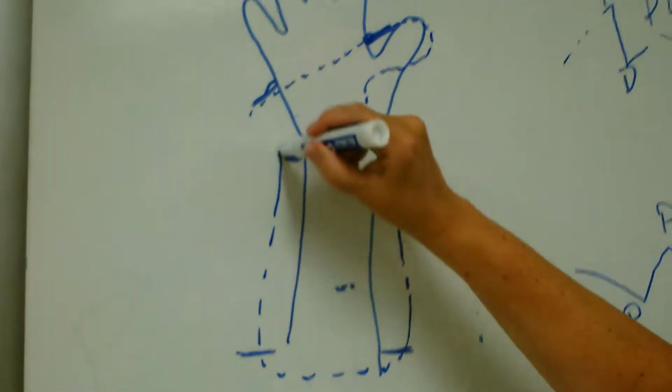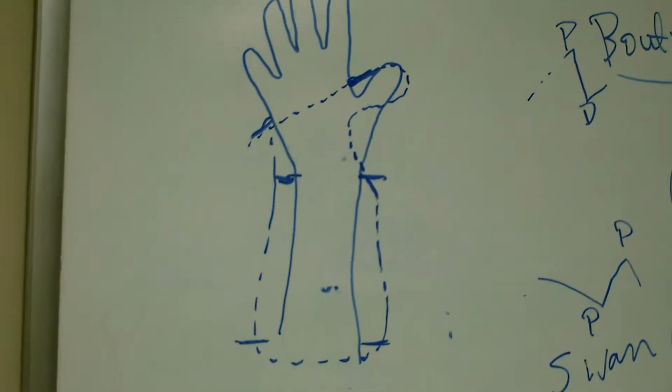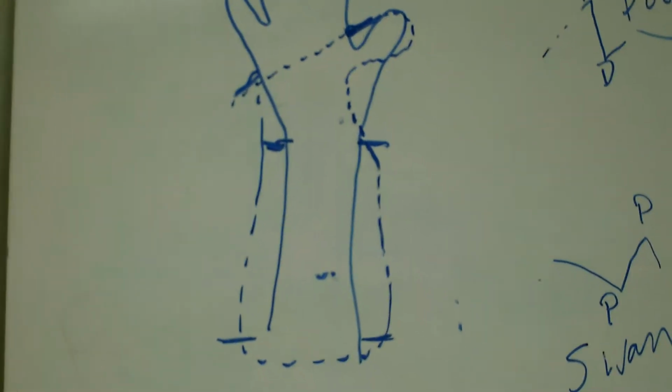Everybody see what I'm doing? And that's your splint pattern. Zoom in, baby. Okay? That little thumb knobby thing is going to go through the web space. Make a pattern. People like Miss Rita, who make splints every day, might not need to make a pattern. You do? Okay. Well, Chrissy, just zip, no patterns. Some I don't, but this I do. Yeah. So, make a pattern.